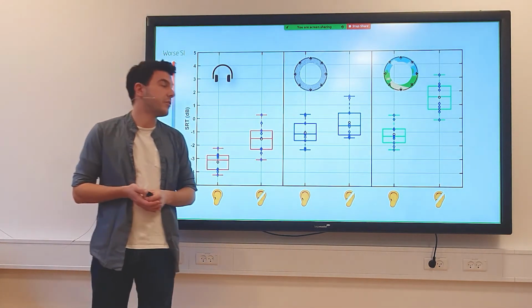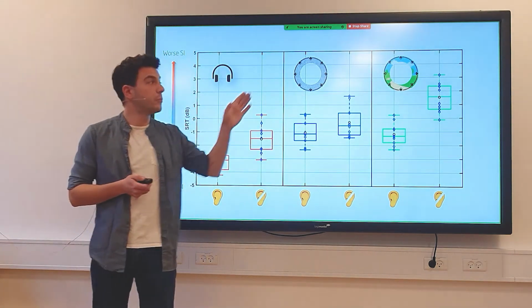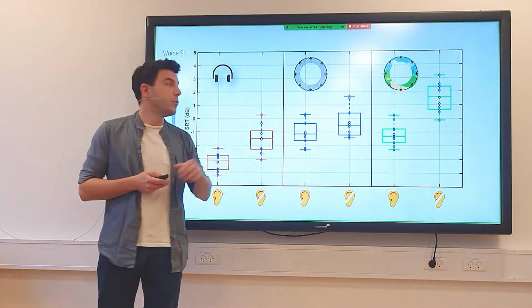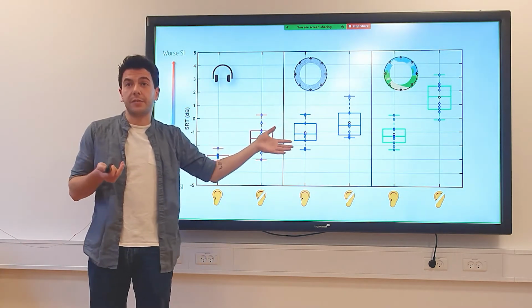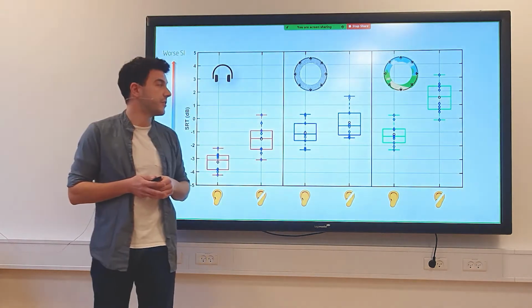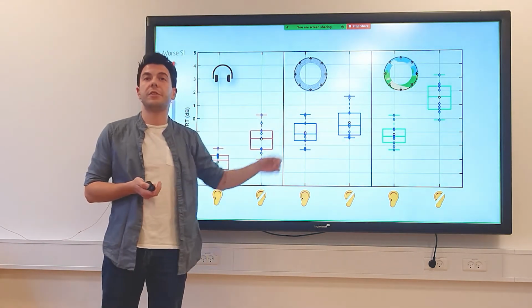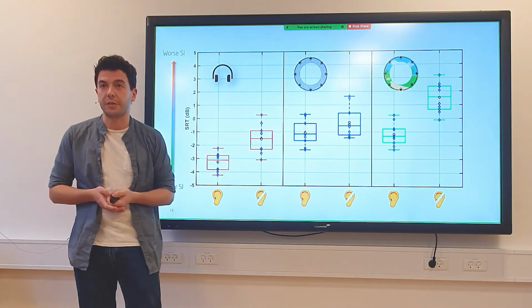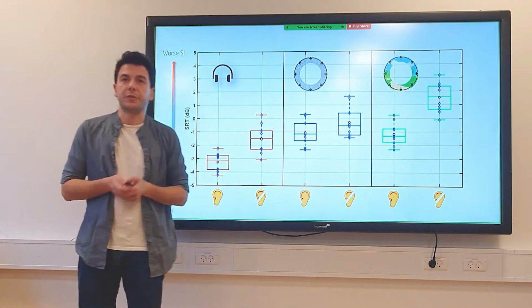And we think that is because normal hearing people can take advantage of the more modulated nature of the background noise in the realistic VSE to improve their performance, but the hearing impaired people can't, or can only do that to a lesser extent. And that improvement compensates for an overall increase in difficulty caused by the more intelligible nature of the background noise in the realistic VSE. So those are interesting observations.